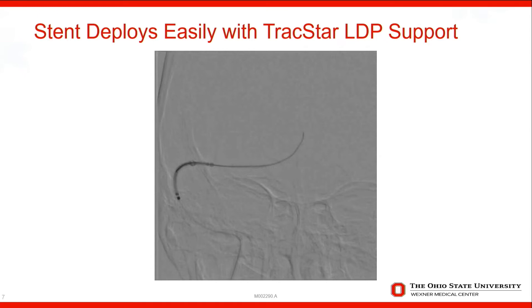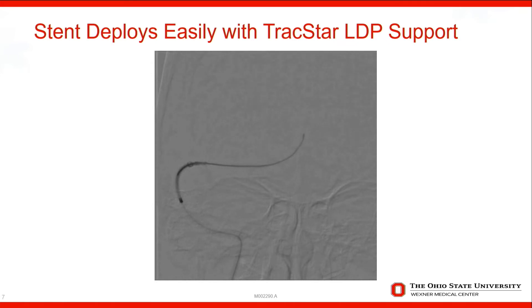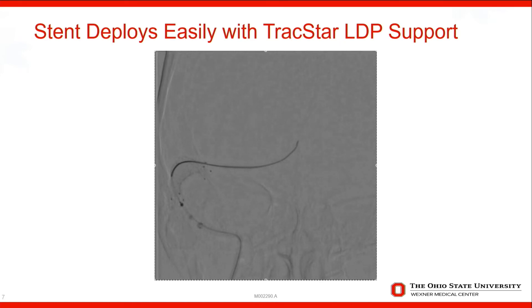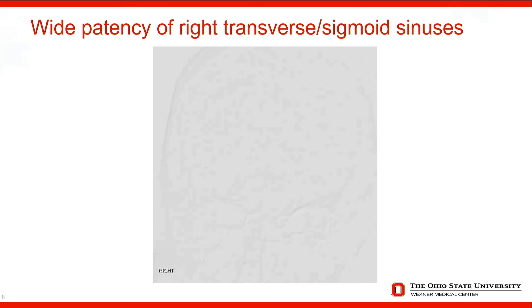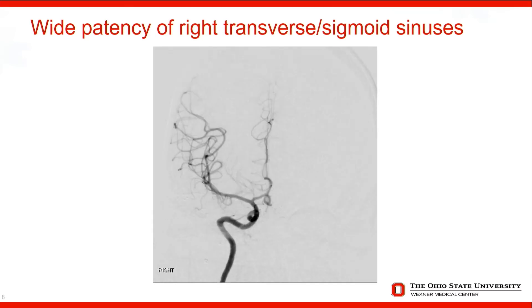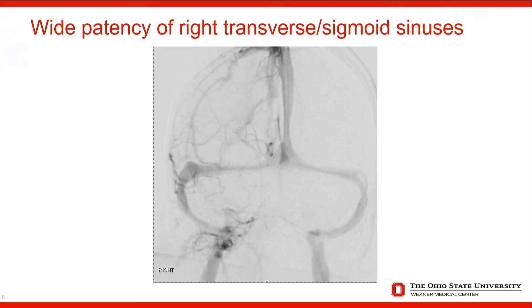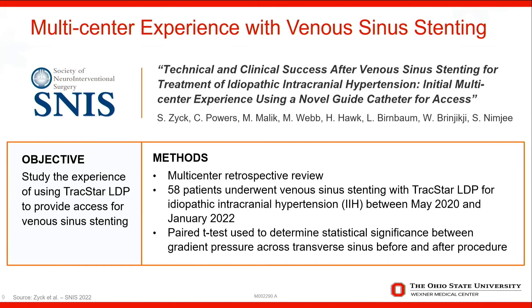So as we transition, we have the catheter exactly where we want it — the TrackStar — and literally all we have to do is apply forward energy with the Zilver stent system. I have a Platinum Plus through this system to provide stabilization, but even more recently I've done a three-stent construct where the TrackStar provides enough support that you don't even need to drop your stent over a wire. You can see how I let the stent evolve in its opening, and the TrackStar comes back as needed. The focal stenosis at the transverse sigmoid junction has resolved, the gradient has resolved, and we've weaned that patient off their Diamox — symptom-free with respect to papilledema going on six months.